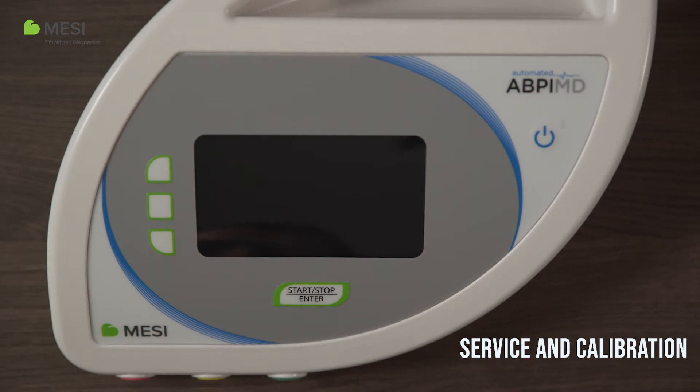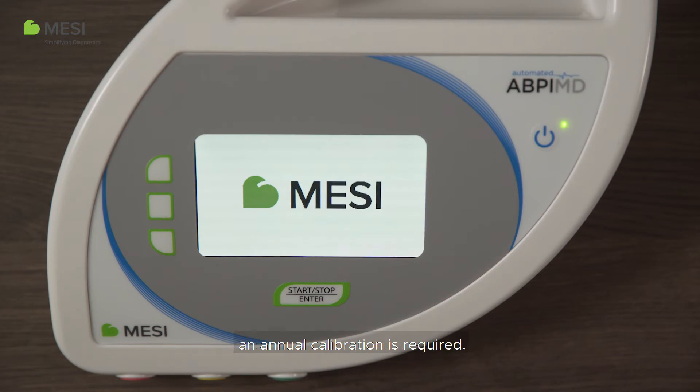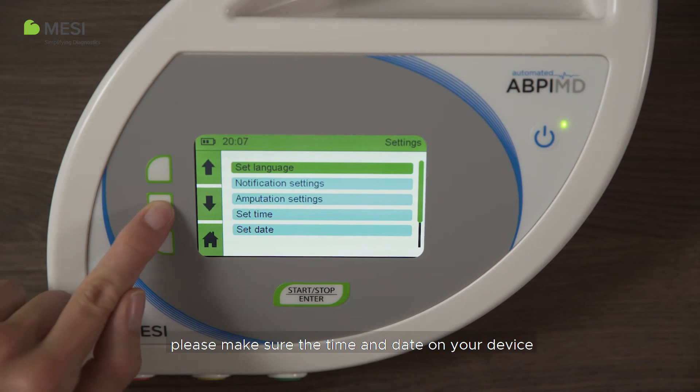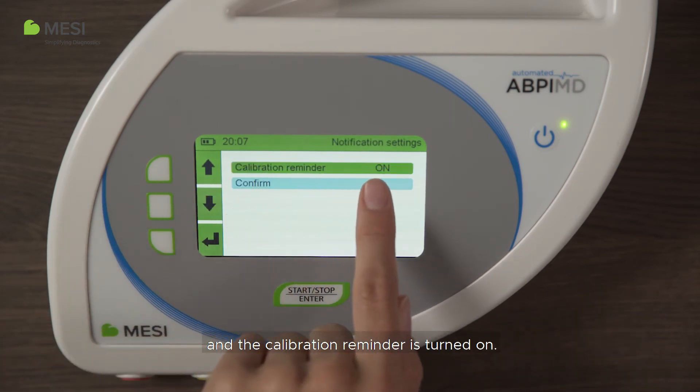Service and calibration. To ensure the accuracy of the Macy ABP-IMD, an annual calibration is required. A calibration reminder will trigger shortly before the next calibration date to remind you to arrange a calibration. In order for the calibration reminder to appear on time, please make sure the time and date on your device are set correctly at all times and the calibration reminder is turned on.